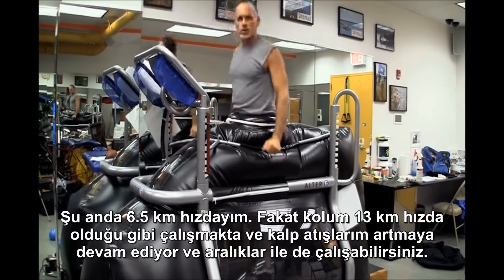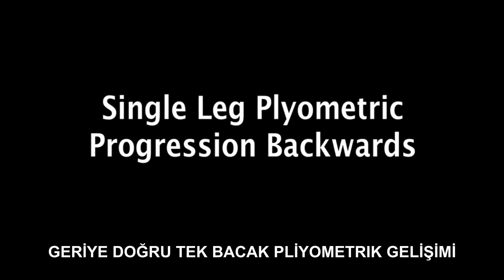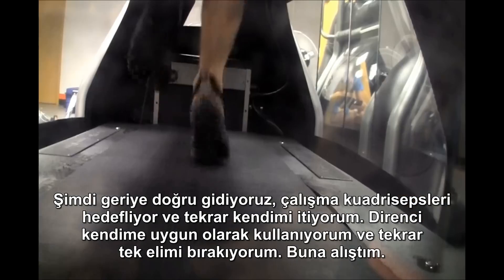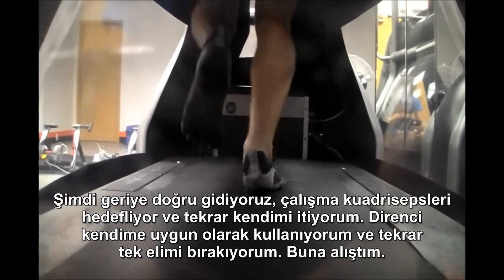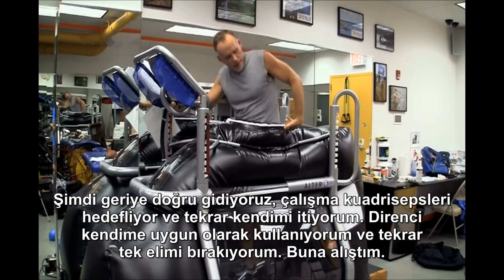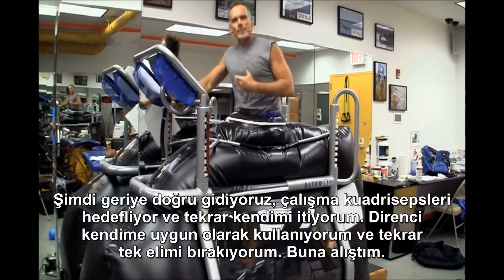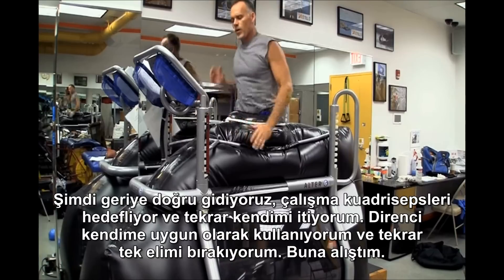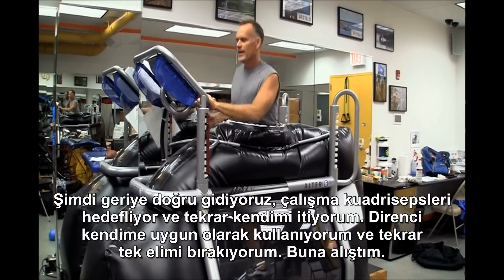And you can do intervals. Now backwards, holding on, really targets the quadriceps. I'm pushing that belt, actually using this resistance to my benefit. Then again, that progression — releasing one arm, holding one arm, getting used to that.